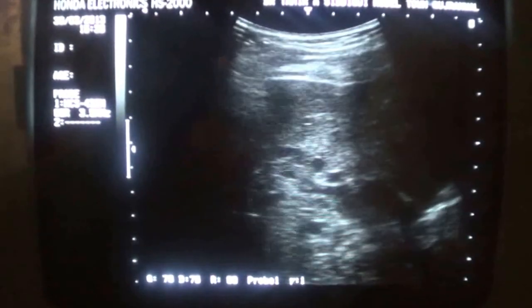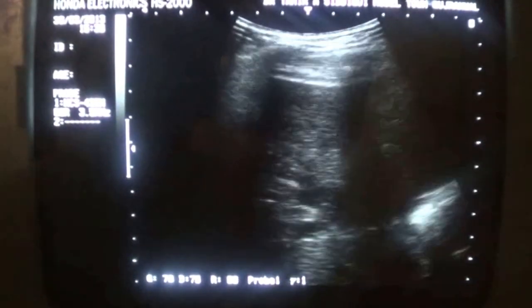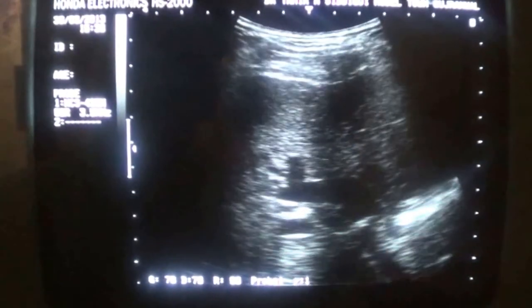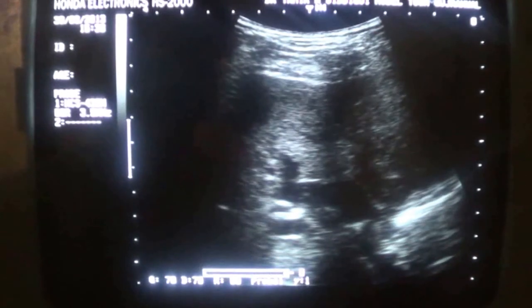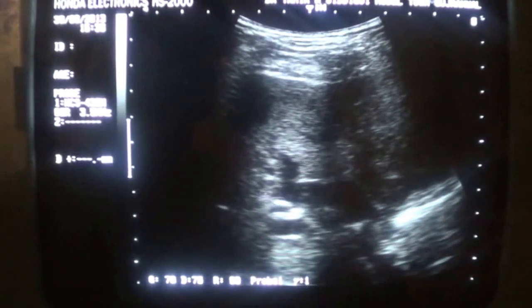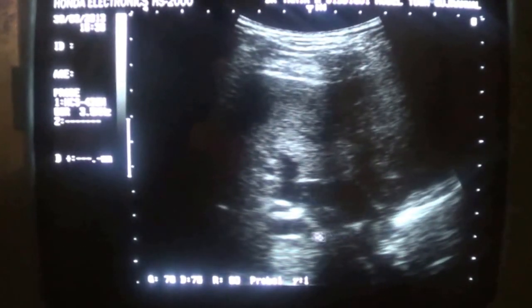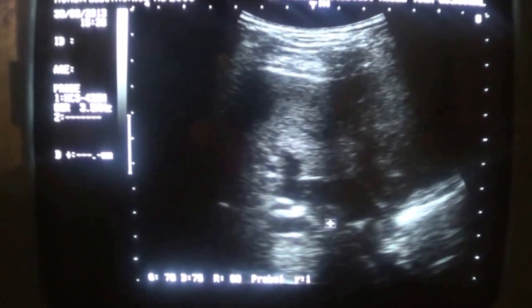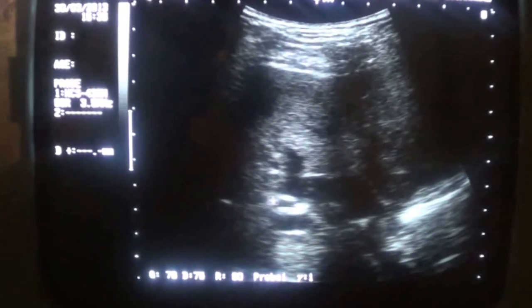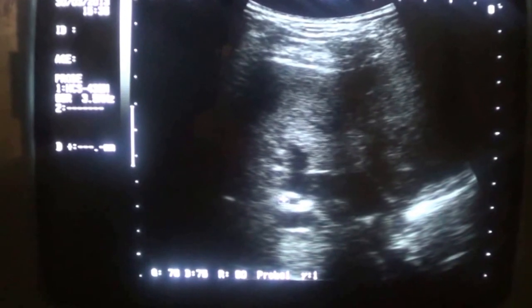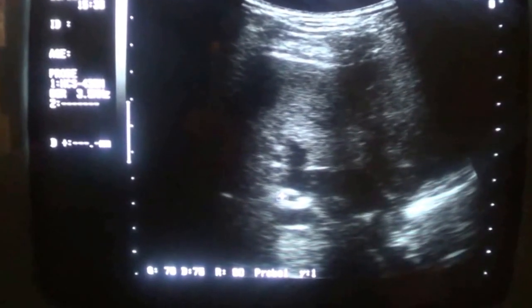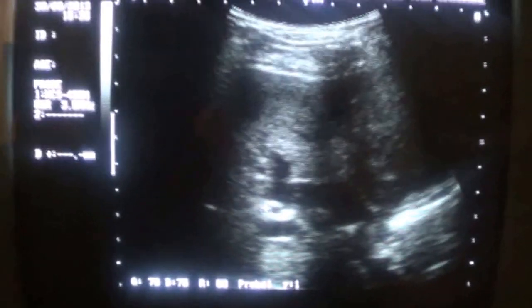This is the dilated common bile duct. This is the portal vein. This is the hepatic artery — the portal triad.